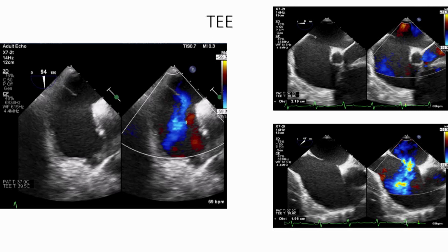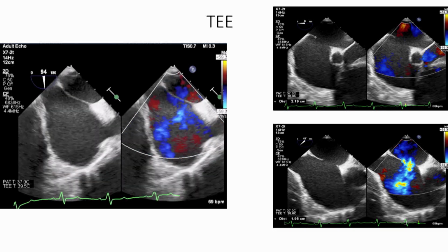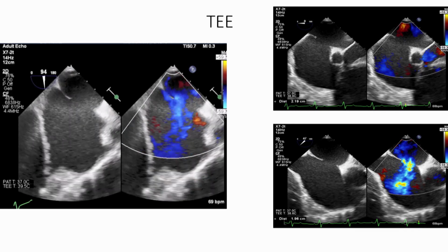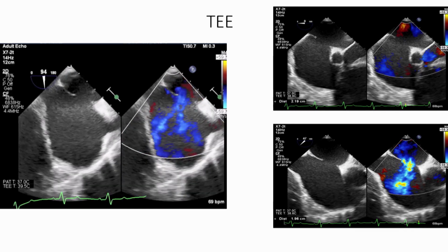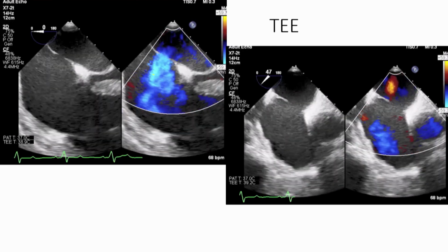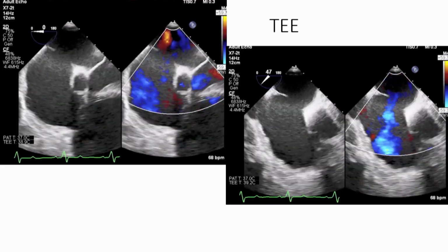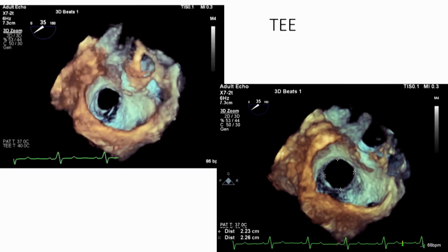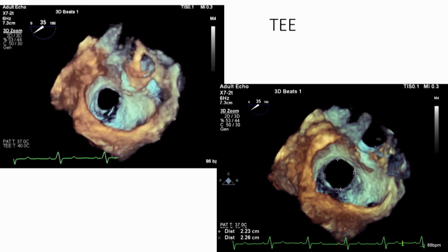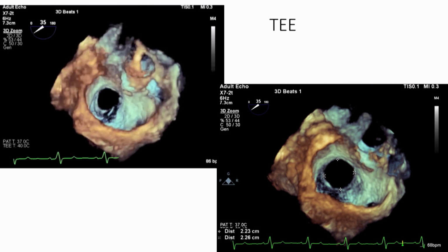This is a transesophageal echocardiogram with a large ostium secundum ASD, 22 millimeter size, left to right shunting. Retroaortic rim is deficient. Other rims are adequate. Now we have done a coronary angiogram too. There is only mild coronary artery disease with mild disease in the OM. RCA, LAD are normal.